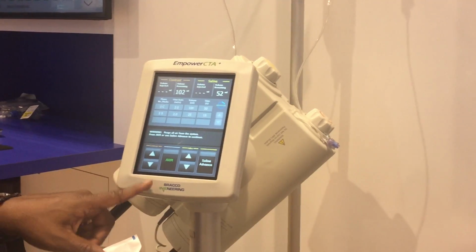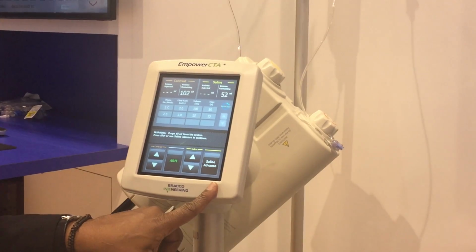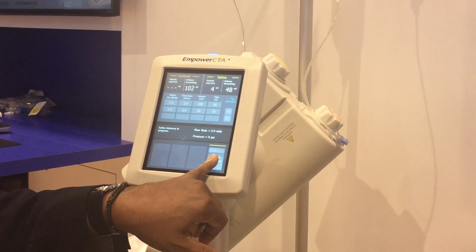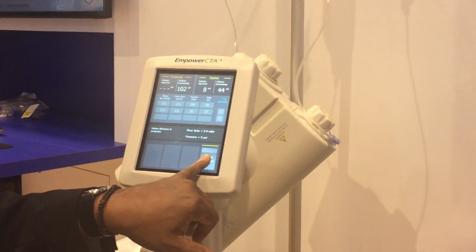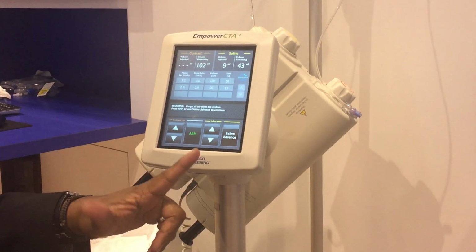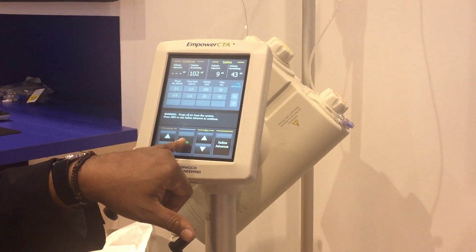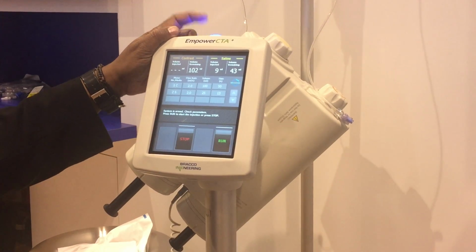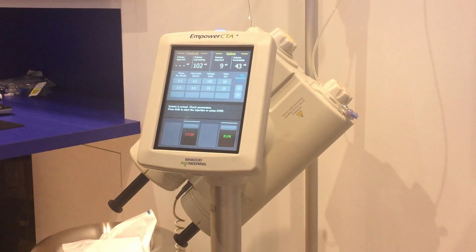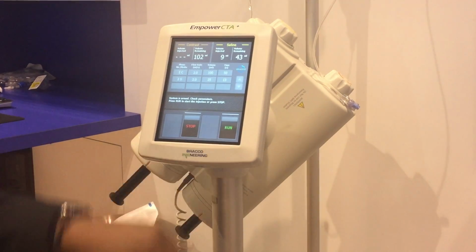I am now ready, before I hit the arm button, to do saline advance. As long as I hold saline advance down, I can feel and palpate at the site. It's a dead man switch. When I release, it stops. If that's good, the scanner's ready to go. I can now arm the injector. I'm going to get a solid blue light again. The system just gave me a prompt that the system is armed and ready to go. I am now ready to press run.